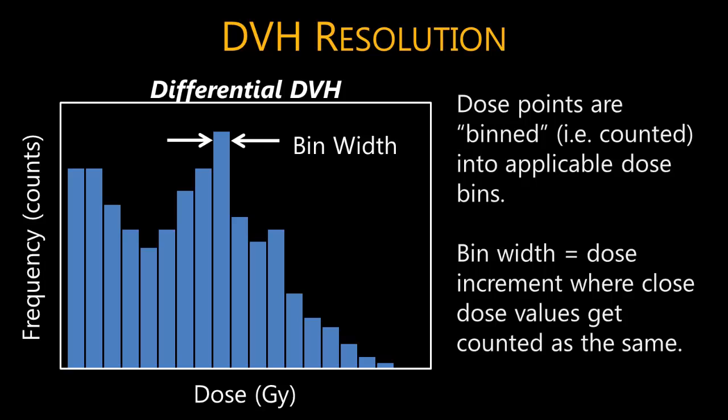There is not only inter-TPS variation in the methods of DVH, but intra-TPS variation due to the different DVH settings and preferences that many treatment planners may not even know about. Dose binning, dose interpolation, structure voxelization, and DVH binning are some of the variables that are core to generating DVH statistics. Consider DVH bin width, illustrated here.